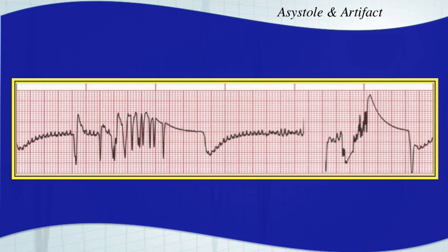Here this is obviously a loose electrode. It's completely distorted the rhythm — you cannot identify the arrhythmia with this loose electrode, so you're going to have to fix that.